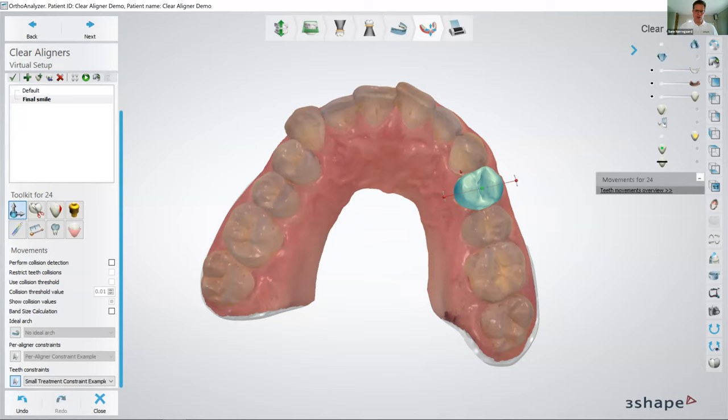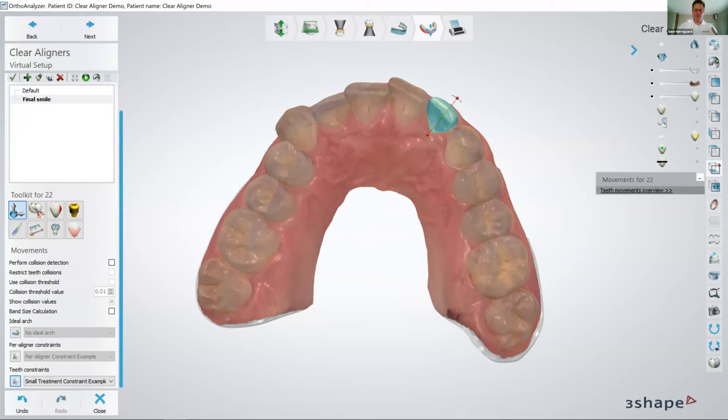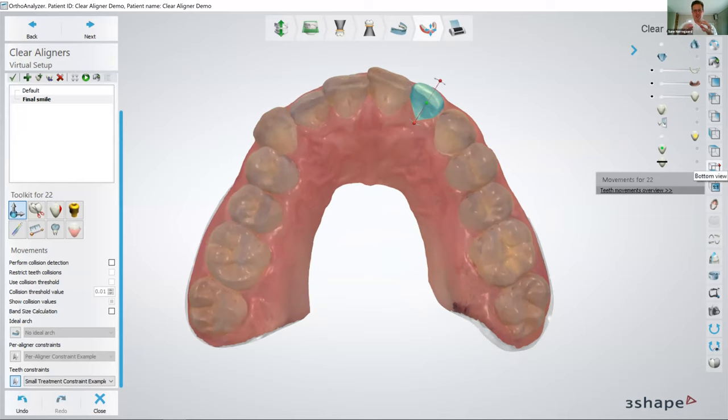You can also just simply grab a tooth with the mouse and then move it around like this. So it looks a bit crazy. The soft tissue will try to follow. And that's if you want to do a really fast setup just to see, okay, how does this look? Maybe that's my goal. And then you want to go back and go step by step to see how you can reach that goal. So that is using the mouse.